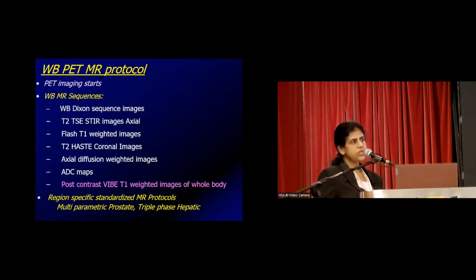Plus, regional imaging sequences depend on the clinical indication of the patient. Patients who are suspected to have liver problems, you obviously need to take a triple phase scan. And for the prostate, definitely we need to study the multiparametric imaging also.